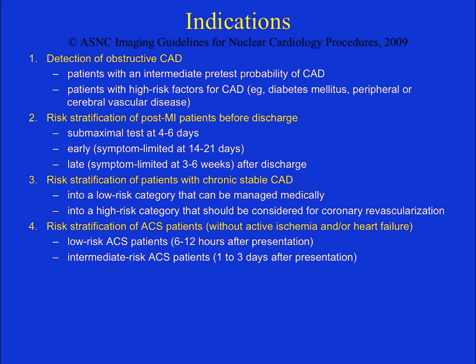And lastly, when the patient has fully recovered, say around after a few weeks or months, then the patient can undergo the classic stress rest myocardial perfusion imaging protocol, and this is to assess whether there is any residual ischemia or not.